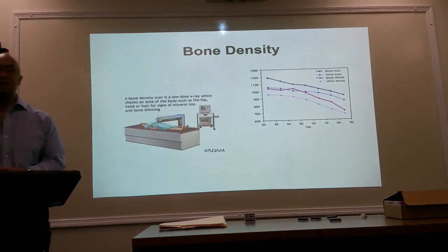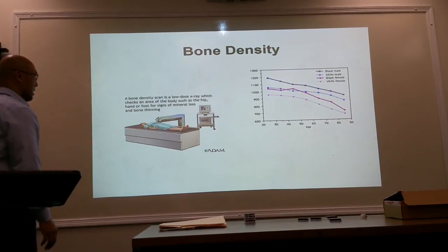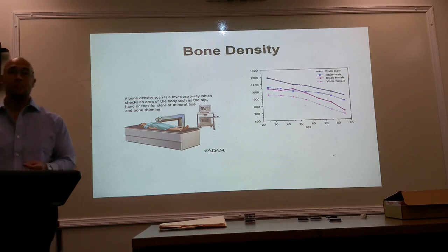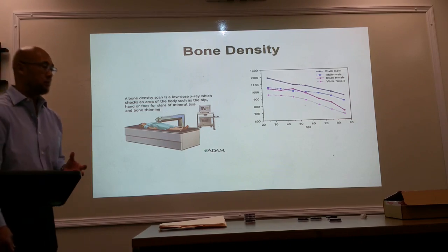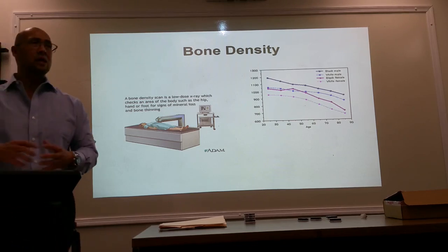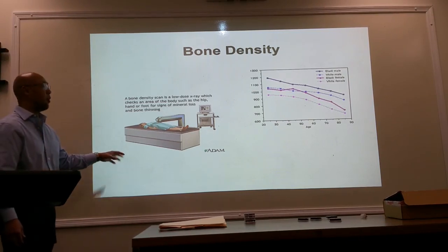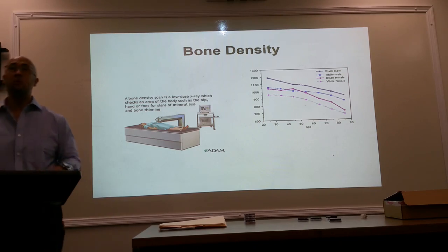All right, bone densitometry is another type of modality that they use, and it's simply just that. It measures the density of the bone. It's a special x-ray equipment. It does use x-rays to evaluate the calcium content of the bone. This is generally done with older patients, or those who have osteoporosis, or some kind of bone pathology.